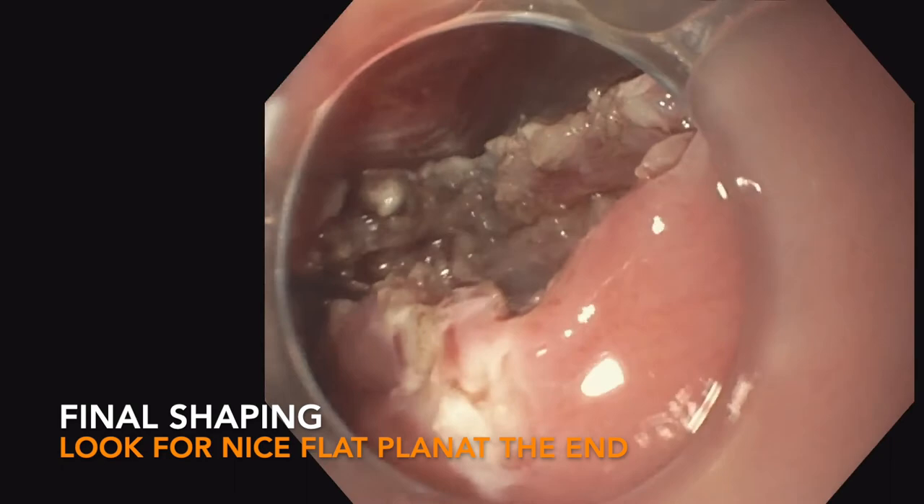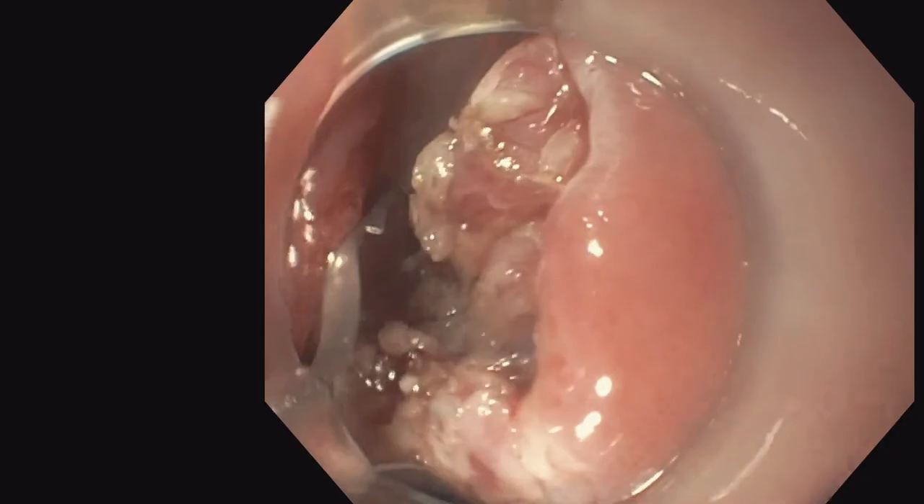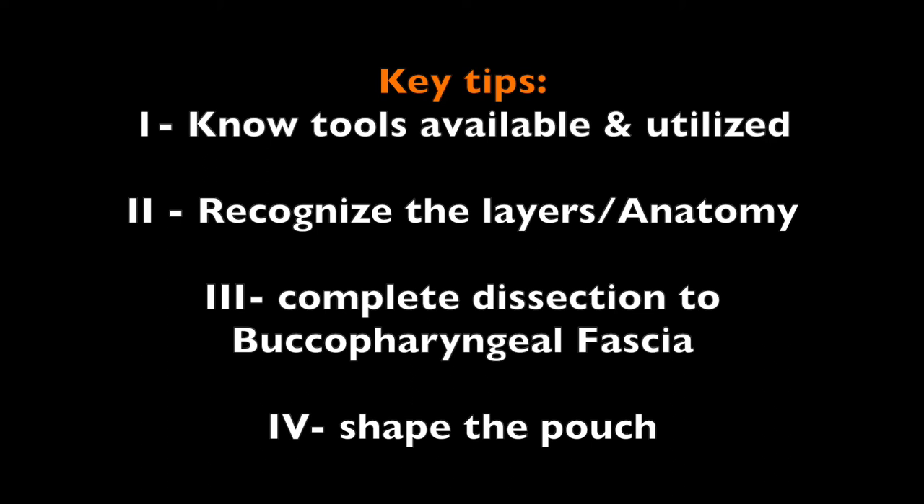Occasionally, we'll use one or two clips at the base of the resection plane. Key tips and tricks: know your tools available and utilized, recognize the layers in anatomy, and complete dissection to the buccopharyngeal fascia and shaping of the pouch — all discussed in this video. We hope that this video is helpful for those who wish to improve their skills in endoscopic diverticulotomy. When performed with the optimal technical approach, endoscopic diverticulotomy can have an immediate impact on a patient's everyday life with long-term durable effectiveness.